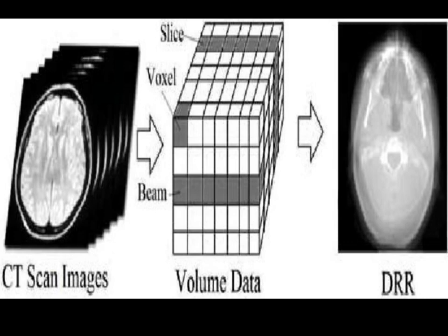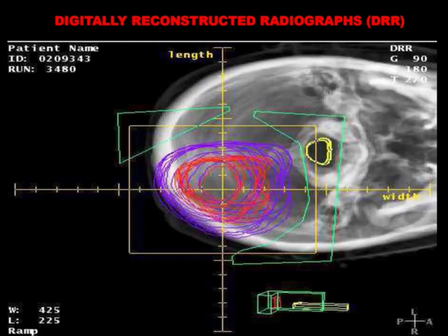Digitally reconstructed images are a simulation of radiographic images produced through perspective projection.